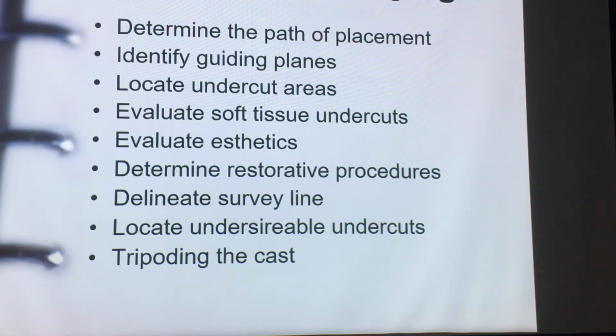Determine the path of placement. Identify guide planes, undercut areas. Evaluate soft tissue undercuts and aesthetics. Restorative procedures and survey lines delineated, which is marking them. And also locating undesirable ones. And today's exercise, tripoding the cast at a given path of placement.